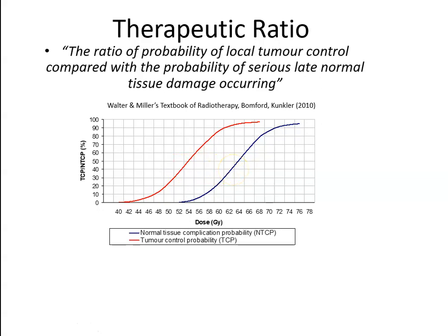You can do some of the approaches of external beam radiotherapy, where we rotate a radiation source around the patient rather than just blasting a patient with a column of radiation that's going to cause effectively an entry wound and an exit wound. If you can focus that on the tumour, then you can effectively give a lower dose of radiation than if you were just bombarding the patient with a cylindrical beam of gamma rays, for example.